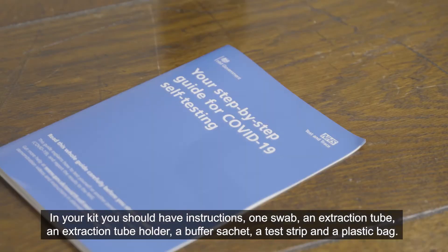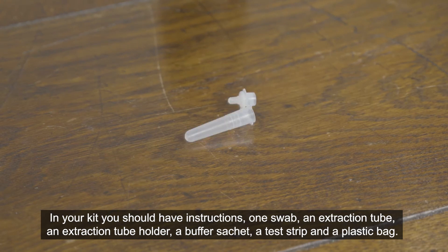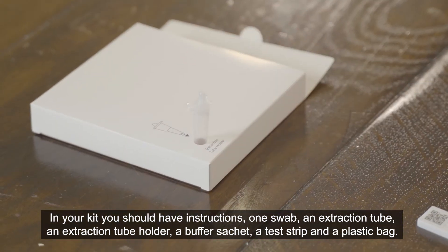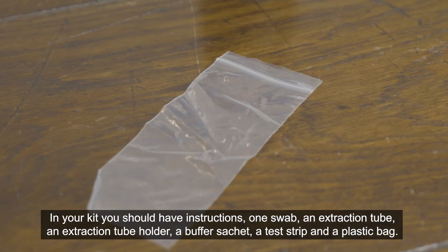In your kit, you should have instructions, one swab, an extraction tube, an extraction tube holder, a buffer sachet, a test strip and a plastic bag.